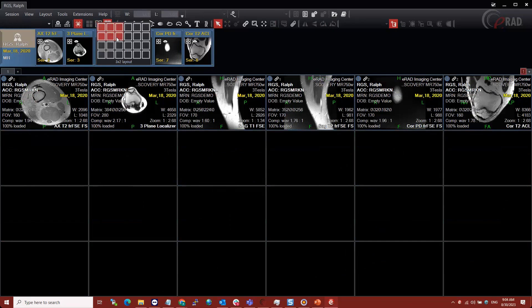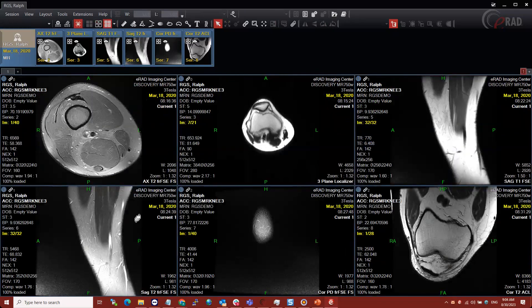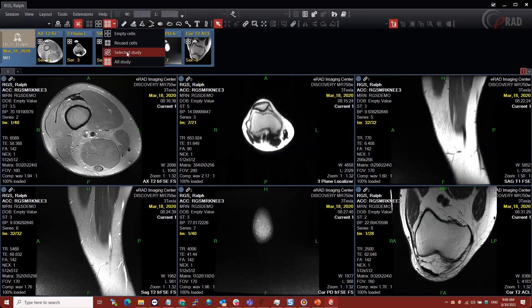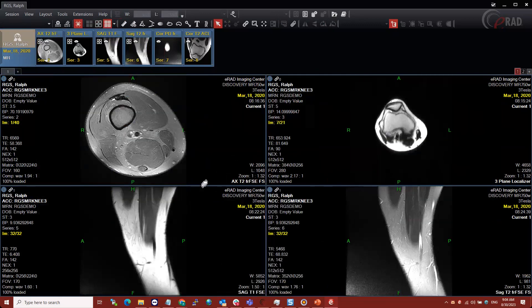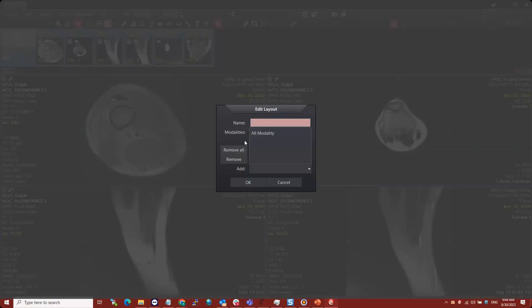If I wanted to create a hanging protocol — say for me, I'd rather have 4 on 1 than 6 on 1, and I just want that to always open up in the order thumbnails are displayed — I'll pick a 2 by 2 layout and immediately save it without dragging anything or manipulating images at all. I'm going to go up here to this create layout button — this little plus sign — which is my method to save a new hanging protocol.